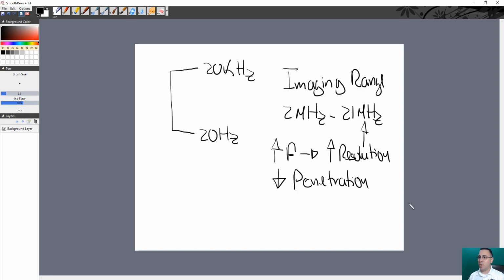So we have the audible range, we have all this information here. What else do we need to know about this ultrasound? All right, the ultrasound is made of particles, and those particles organize in zones where the particles are together, and then zones where the particles are apart, like this. And then one more time another zone where the particles are together, and then another zone where the particles are apart.